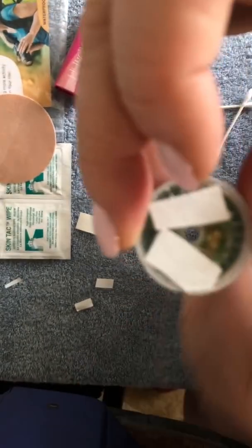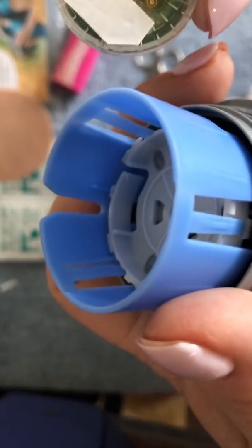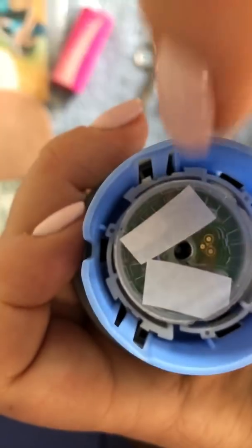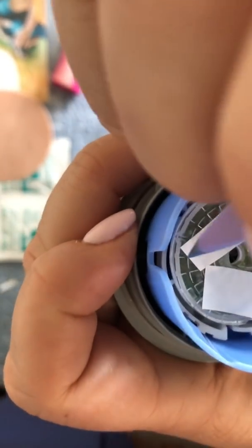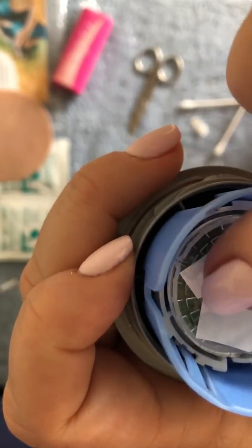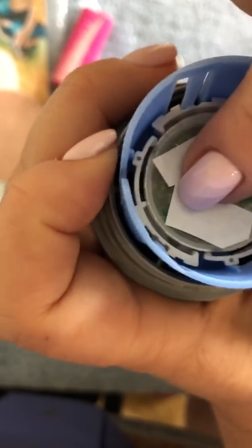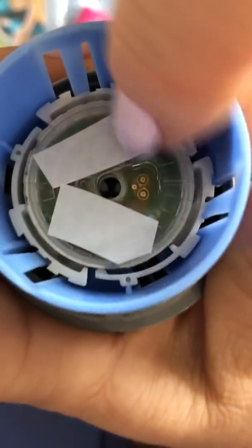So here comes the important part, and I want everybody to notice this. If you remember, I talked about how you had that deep groove, and then you have the 3 dots right here. It's important that when you put this back in here, you line those 3 dots up with that groove. And I just kind of use my tweezers to get it there, and then when I'm done, I snap it into place, and you'll hear it click. And just make sure that it's snapped into place all around, okay?